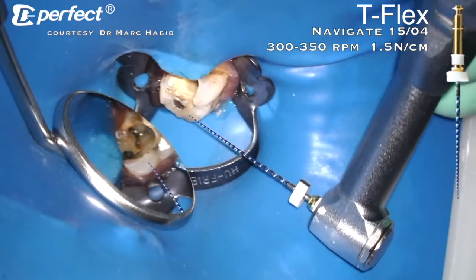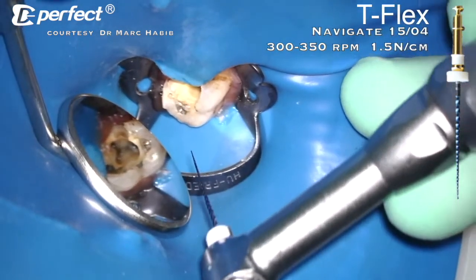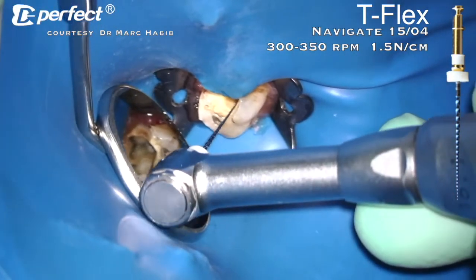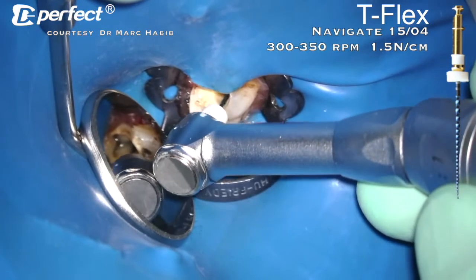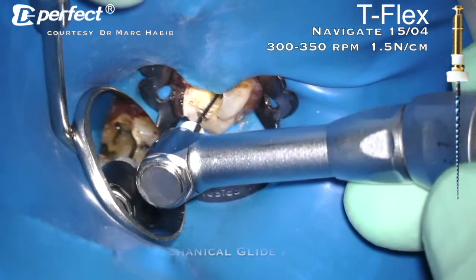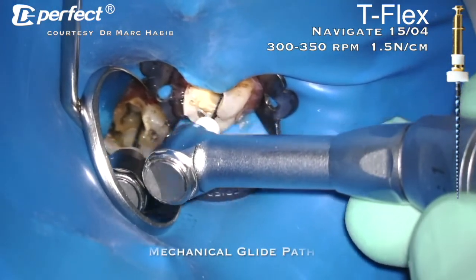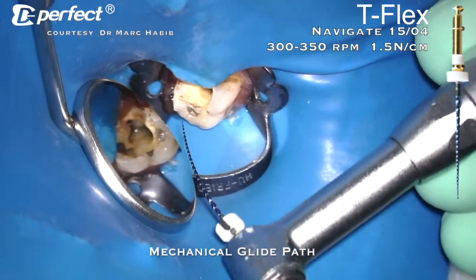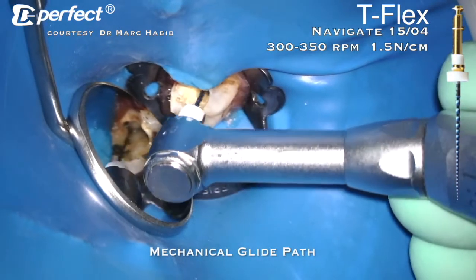Now we are using the Navigate. This is a glide path file. The Navigate is a 15 diameter at the tip with 4% taper to achieve a mechanical glide path. We can pre-bend it to make it easier to have better access to each canal.